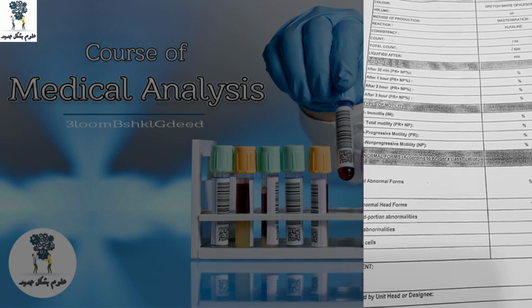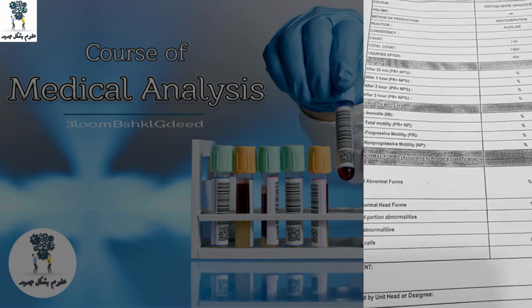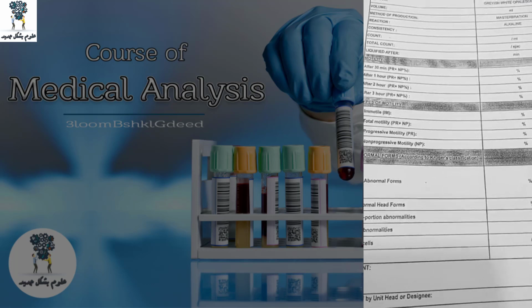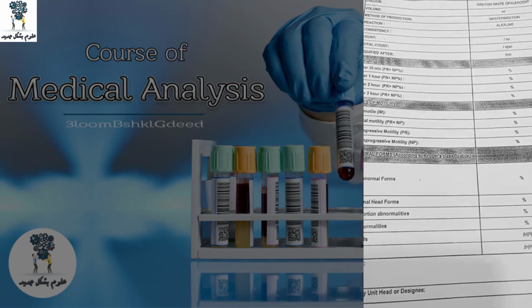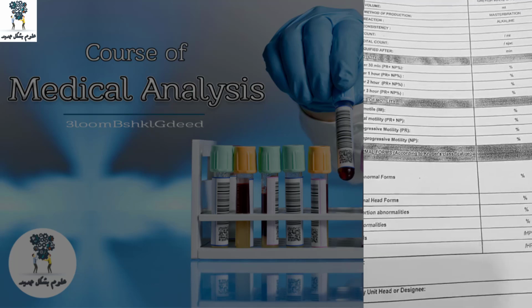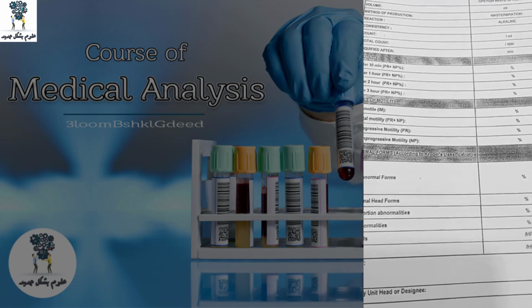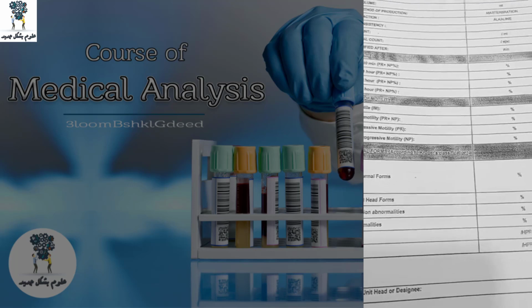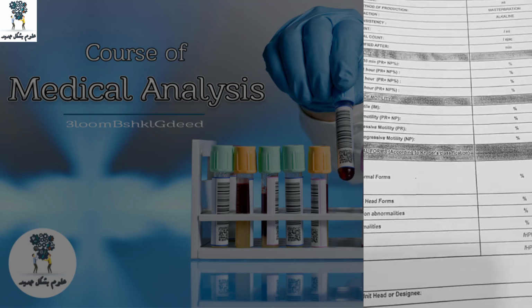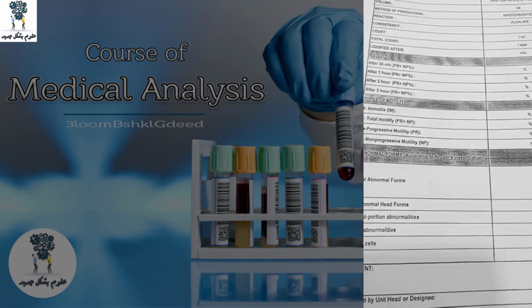نيجي للجزئية، احنا قلنا إن احنا بنفحص العينة بعد نص ساعة من وضعها في الحضانة عند درجة حرارة 37 درجة سيليزيوس. طيب لو العينة بتاعتي كانت شديدة اللزوجة، يعني إيه شديدة اللزوجة؟ يعني عبارة عن سائل متماسك، مش قادرة آخده بالبيبات، مش قادرة أسحب السامبل 10 مايكرو، مش قادرة أعمل له dilution. So in this case احنا بنحطها في الحضانة نص ساعة كمان، وبعد كده نبتدي نعمل الميثود بتاعة التحليل.